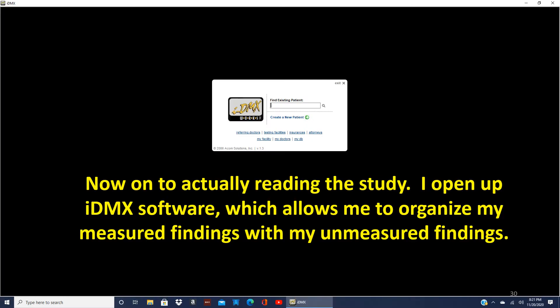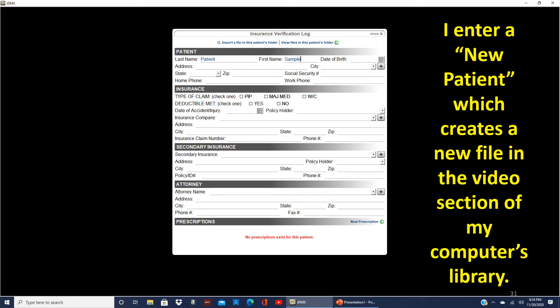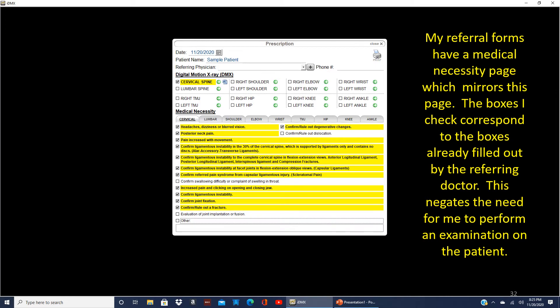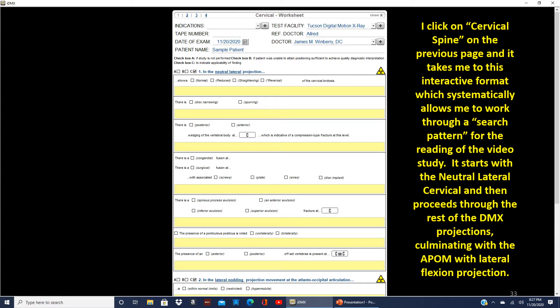Now on to actually reading the study. I use IDMX software, which is the interactive software that Dr. John Postalwaite includes with the Visualizer 2000 when you buy a machine. It has a process for evaluating the cervical spine and also has a report form for the lumbar spine, the TMJ, and the rest of the appendicular joints. I enter a new patient, which creates a new file in the video section of my computer's library. I click on cervical spine, and it takes me to an interactive format which systematically allows me to work through a search pattern for reading the video study.